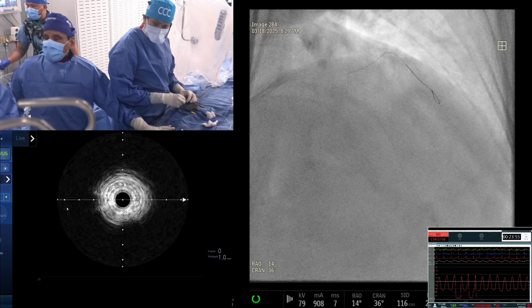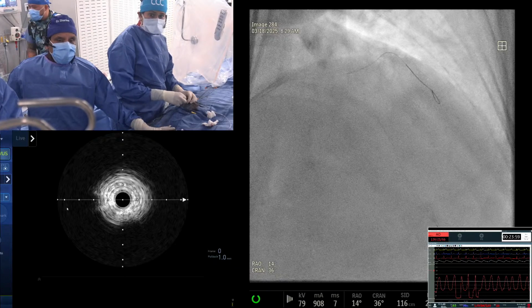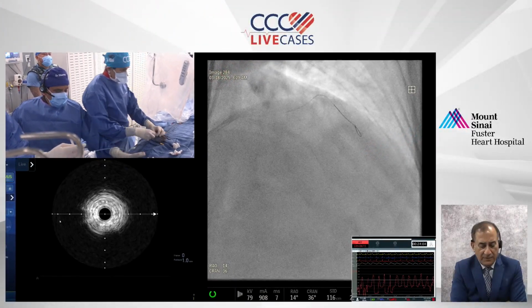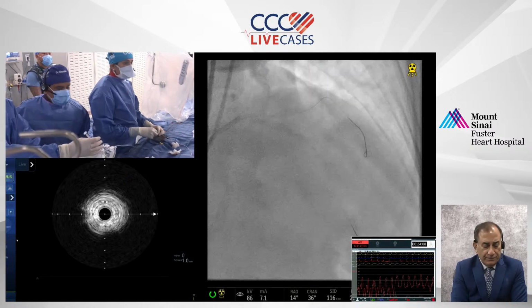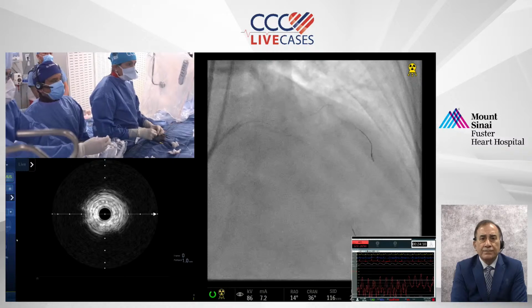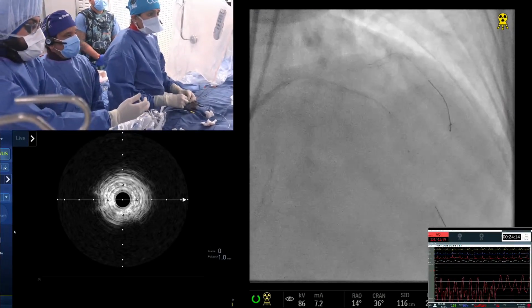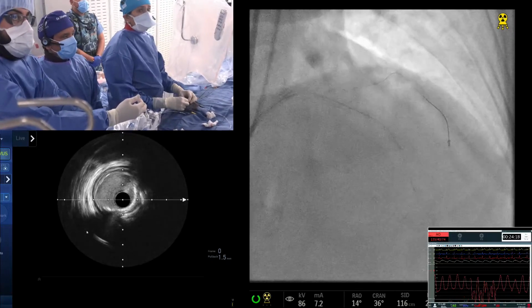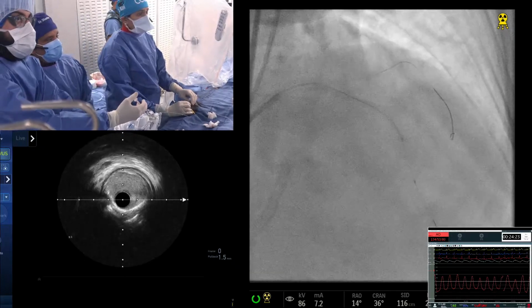Okay. We are ready. Let's bring the IVUS. Yeah. Anu, a lot of compliments here for your rotablation for both the branches. Thank you. Now I was going to say, lots of practical tips, and I think now it is time to learn how to guide out a little bit. Yeah, there it is better. Okay. Start pullback.